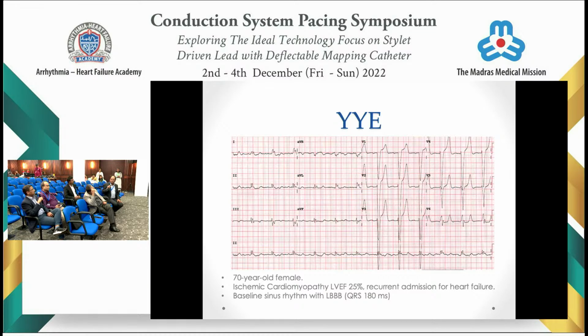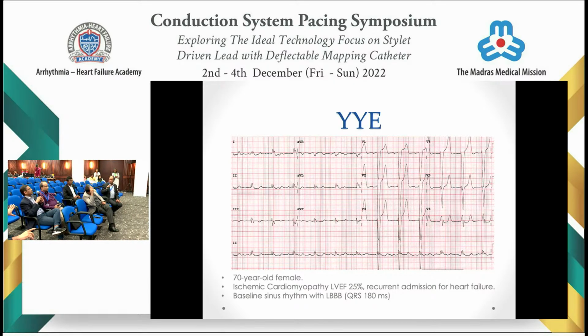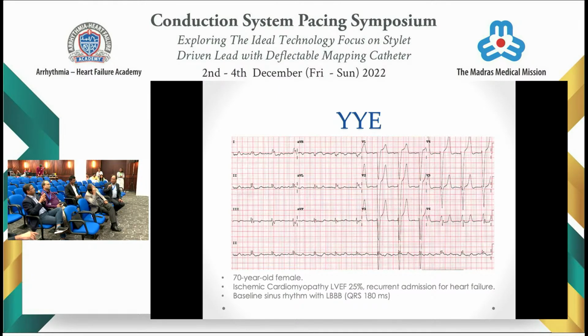But it'd be naive of us to say that all patients with right bundle branch block will not have left-sided conduction delay. I don't think that is a correct statement. No, I didn't say that. I said if the left bundle is conducting normally in a patient with heart failure who has right bundle branch block, pacing the right bundle branch will not resolve the heart failure. That's what I mean.